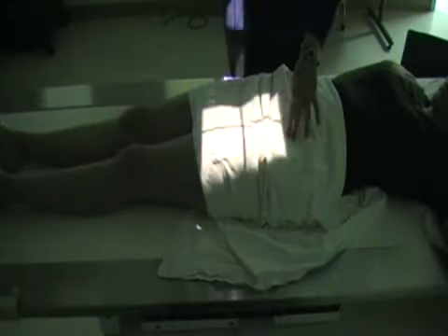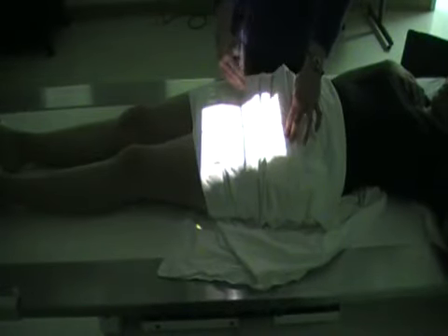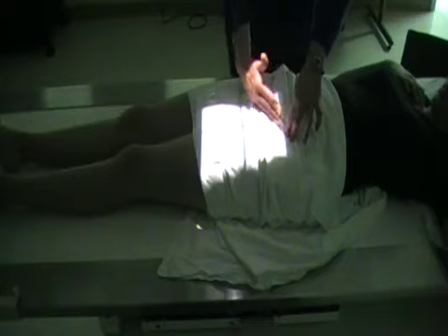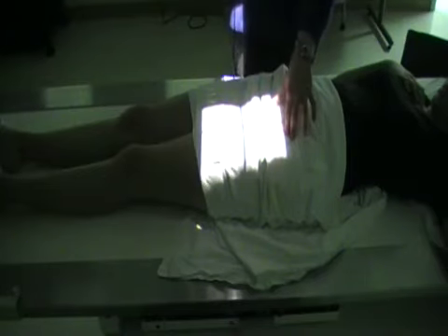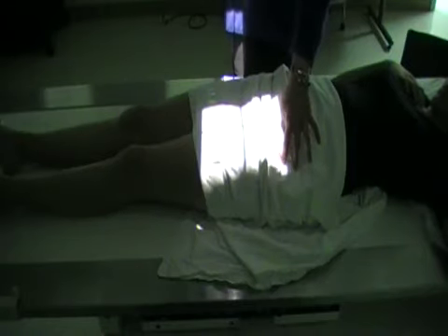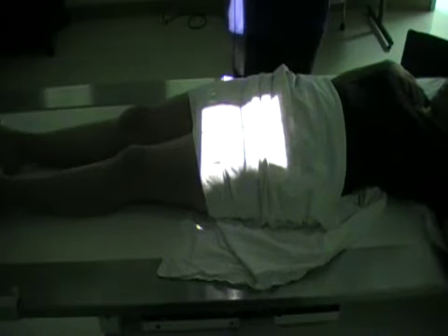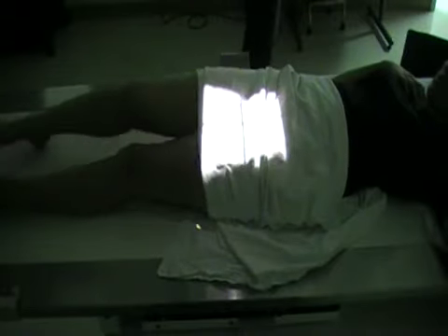And if you want to double check, you can draw your imaginary line from the ASIS to the pubic symphysis, okay? And then you're going to go down about 2.5 inches to be at the neck of the femur. So this is our AP of the proximal femur. Next we're going to do a lateral, so I'm going to have the patient roll up onto the left side.